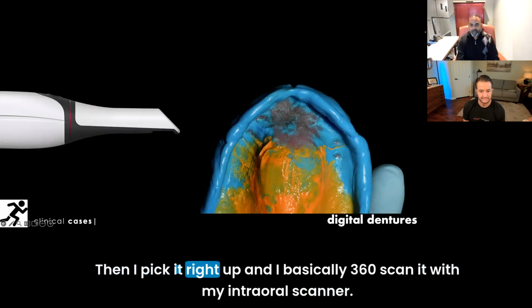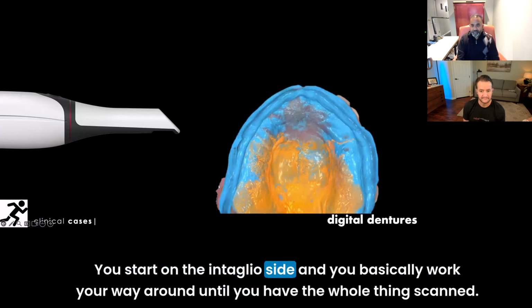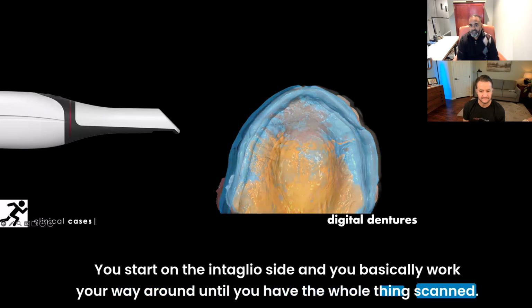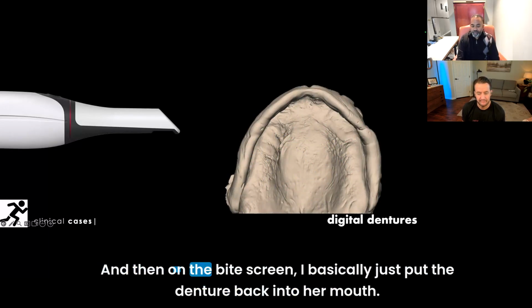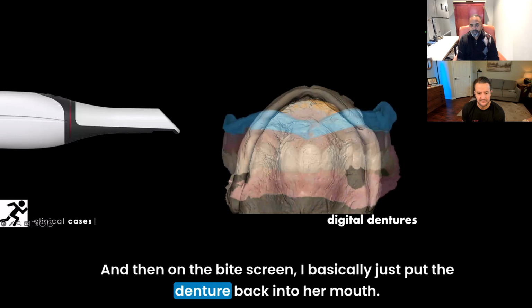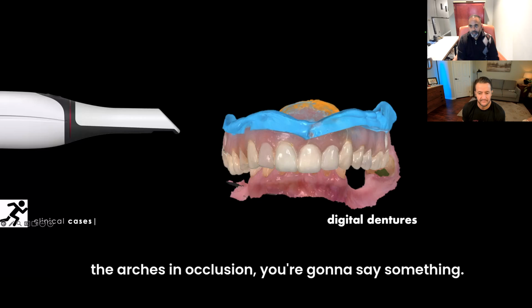Then I pick it right up and I basically 360 scan it with my intraoral scanner. You start on the intaglio side and you work your way around until you have the whole thing scanned. So now I have that. Then I scanned the lower arch the best that I could. And then on the bite screen, I just put the denture back into her mouth. I had her bite into her normal bite. And now I have the arches in occlusion.